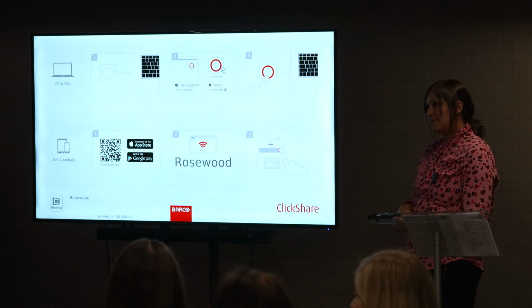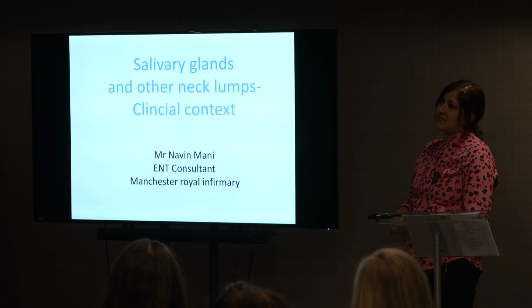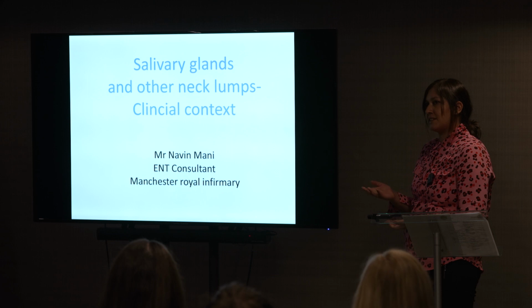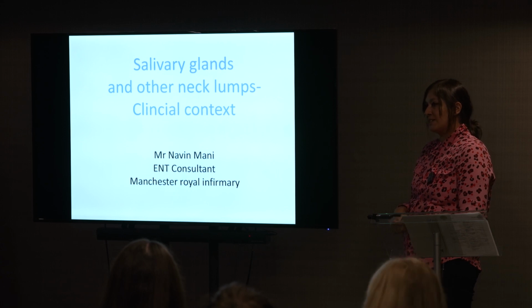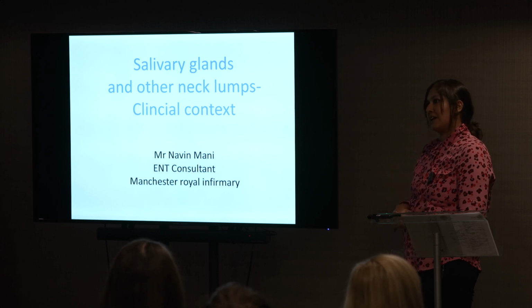Yeah. 2 questions, is that right? So the first is, if you're doing an FNA for a cystic lesion, I was told that you try and get some of the cyst contents and then you try and get some of the wall. Yes, right? Yeah, that's correct. Perfect. Yeah, so that's really important as well, because any cystic contents may just come back inadequate or with inflammatory debris and stuff like that. But targeting the wall is a key thing as well. So that's one of the key things that we do when we're differentiating between branchial cleft cysts and SCC metastases. We always target the wall as part of these samples.